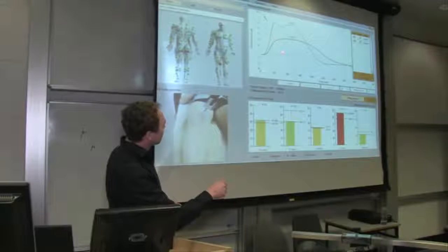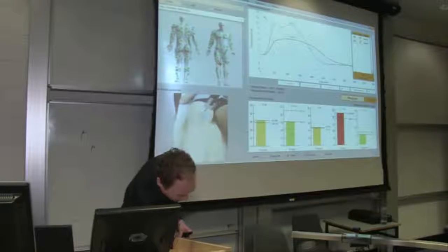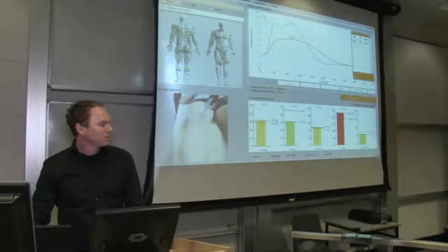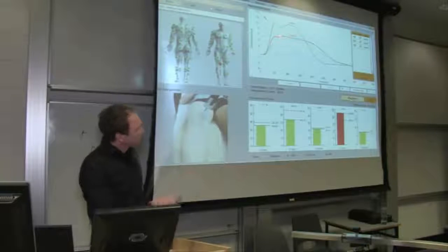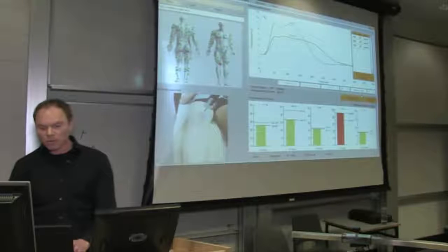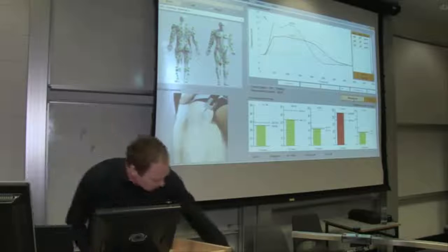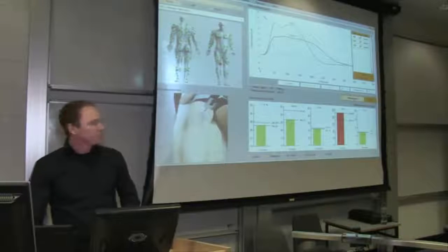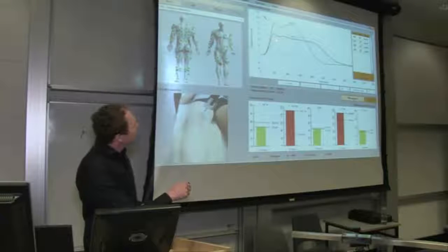So that was the first measurement. This is the second one. I'll go to 30. Measure again. So you can see that this is now increasing. Usually what I do is I'll keep for now maybe one or two more. Okay, let's go to 40. Measure again. So you can see it's still increasing.